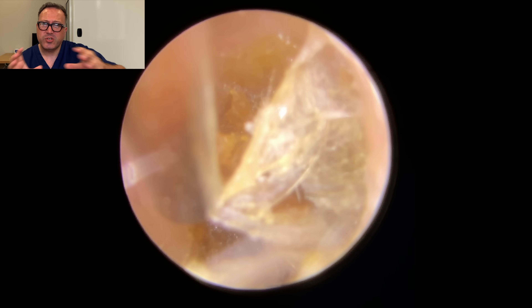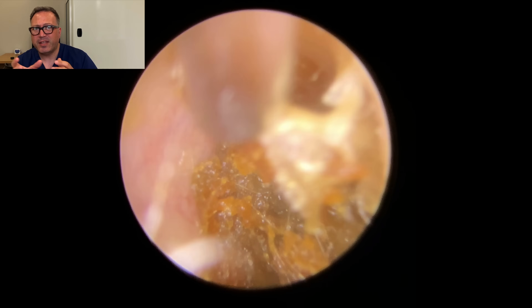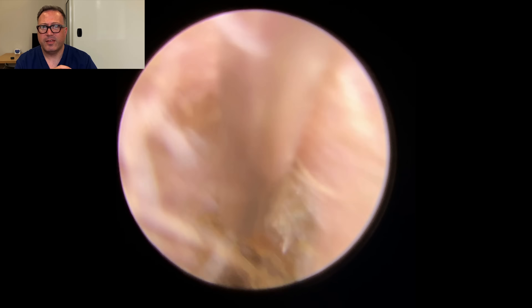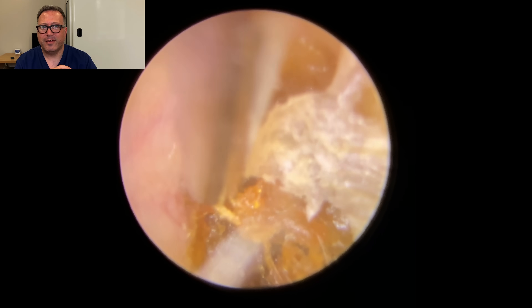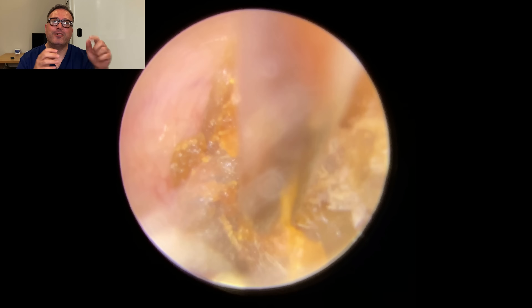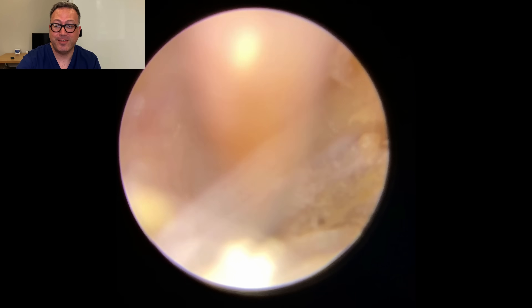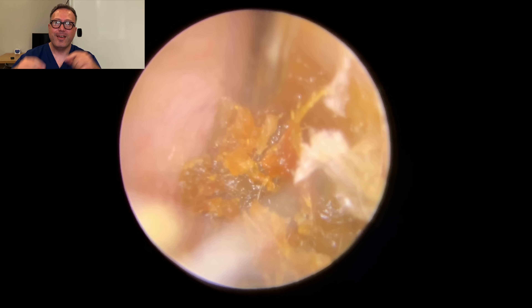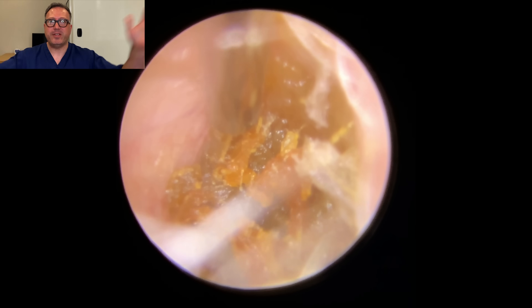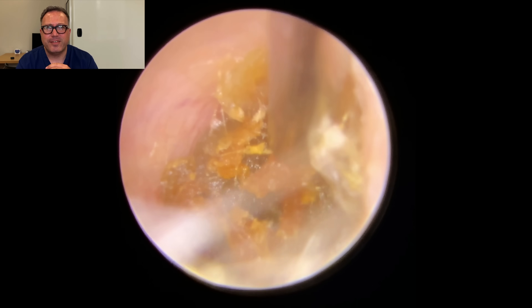Just trying to free up the next section. This is all about loosening and freeing up sections to be able to take them away — it's so well bound in there. I'm glad I've got my glasses on today — I can actually see a lot better. A lot of people are mentioning in the comments that I've not got my glasses on again. It's because I'm concentrating so much on getting things right for the video. But yeah, at least I can see a little bit better today.